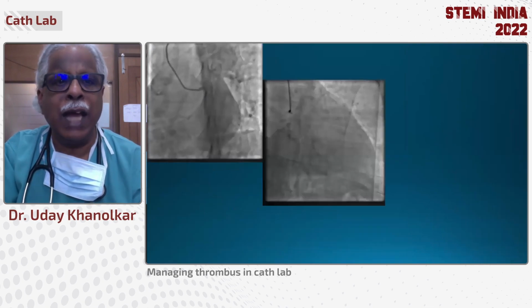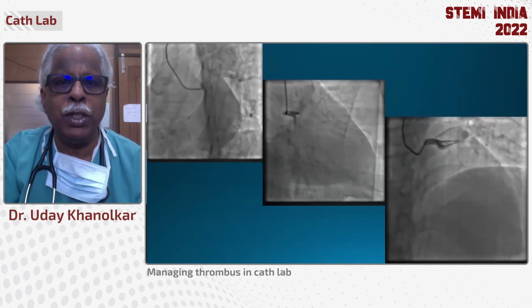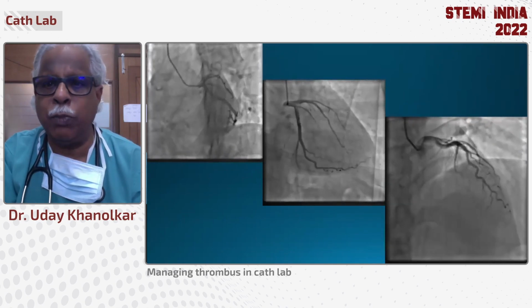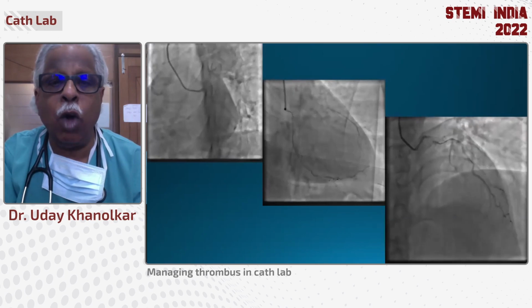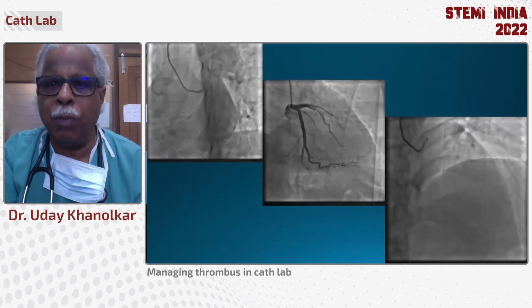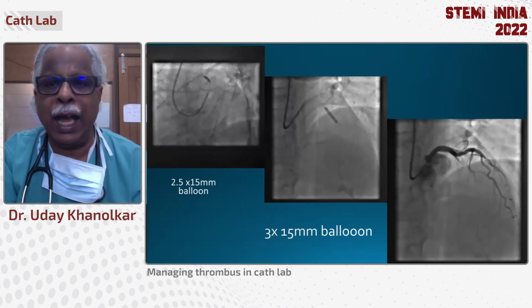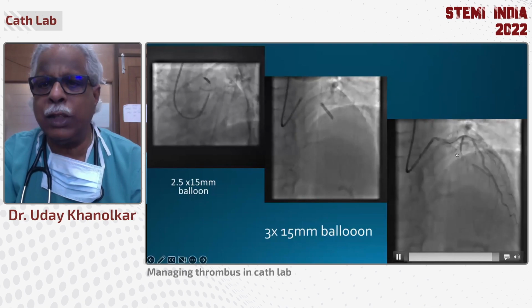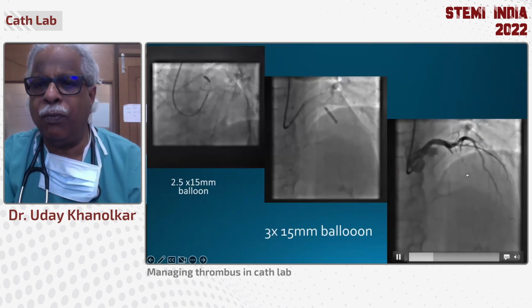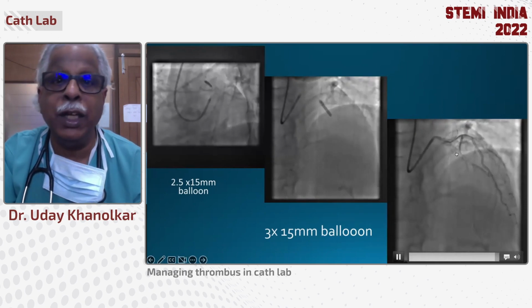Coronary aneurysms are very notorious for thrombosis. They can have a thrombus, as for example, this gentleman who presented to me with an anterior wall MI. We did an angiography: total occlusion of the proximal LAD. We did balloon dilatation with graded higher balloons, but you see there is a thrombus there. There is a trickle of flow, not even TIMI grade 1, and there is a large thrombus sitting over there.